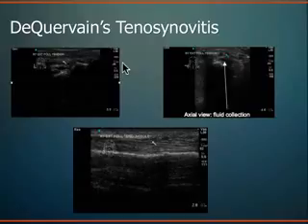And as I mentioned earlier with tendinitis, you tend to see fluid and a collection of that inflammation. So you're going to see fluid surrounding the tendon. What you have here is a short axis or axial view of the tendon. This is that little dot of the tendon running lengthwise as you're looking down the tendon. And then what you'll see is this anechoic fluid collection around the tendon as a halo, which we also refer to as a target sign. That's basically fluid in the tendon sheath. So that's your tenosynovitis, and you can see that very nicely on the ultrasound.